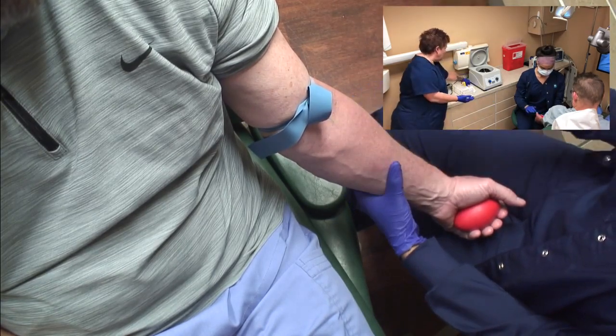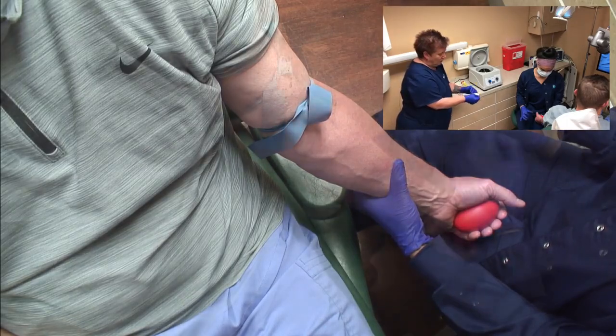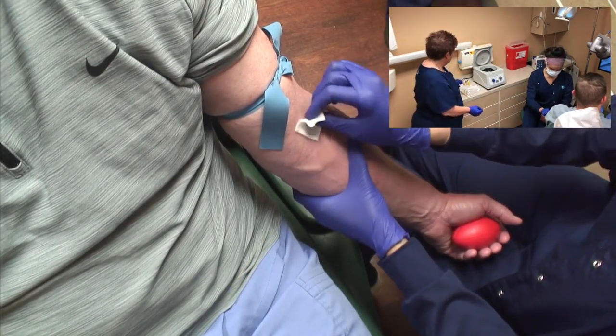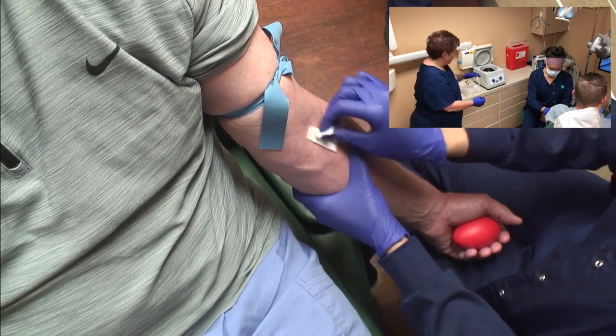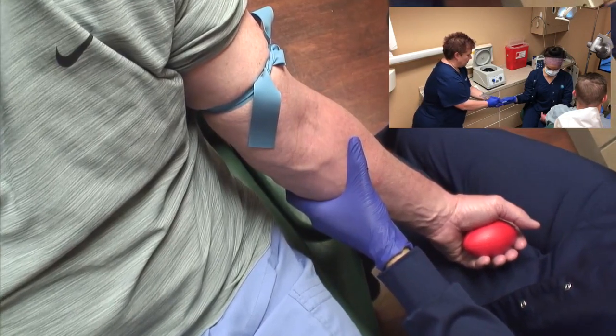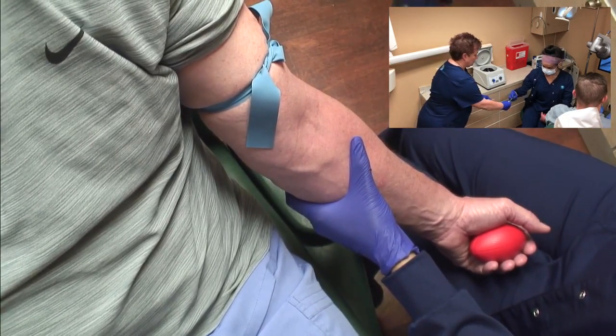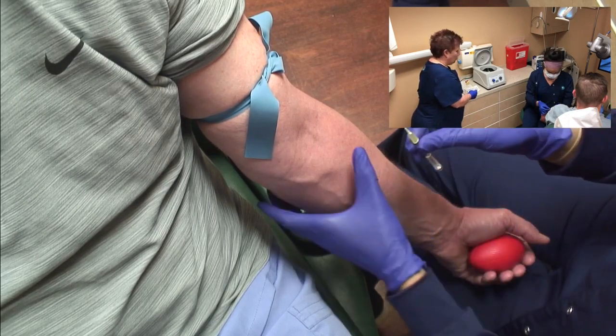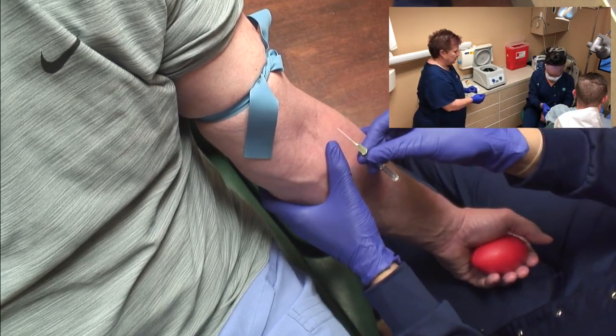So now I'm going to step back. I'm going to open up the alcohol. So I'm going to hand China an alcohol swab. She's going to cleanse the area. I'm going to open up the catheter, loosen it, and hand it to her. She's going to turn the bevel so that it's up.